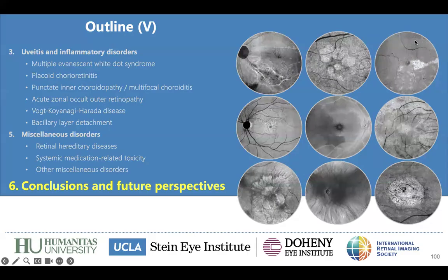Well, Alessandro, it's kind of breathtaking imaging, and well, I love retina imaging. You are aware of it, and these are really, really great. I have a question for you.